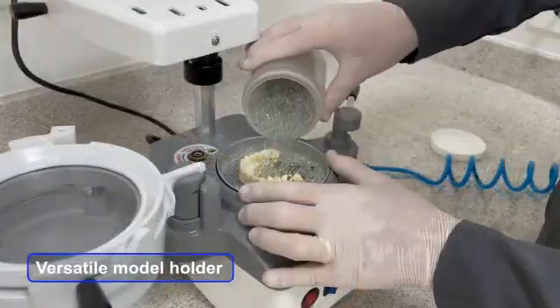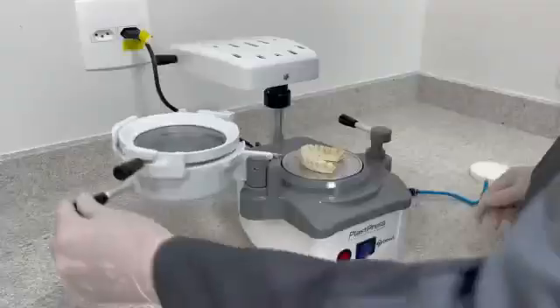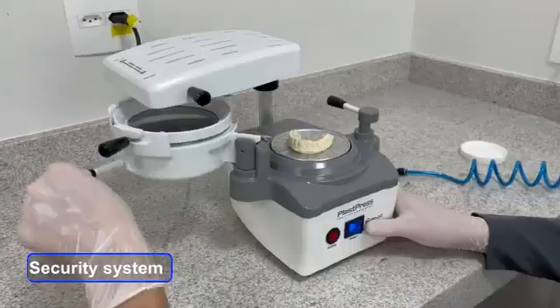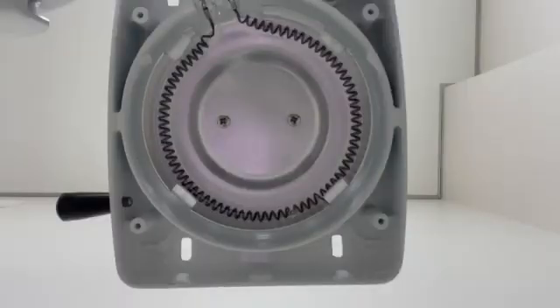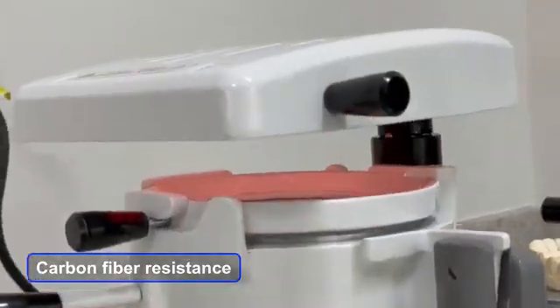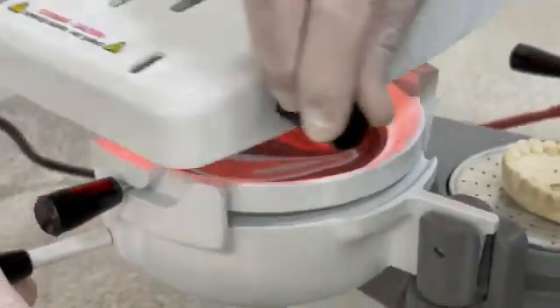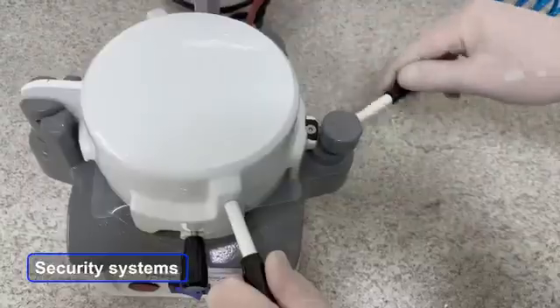Model holder with dual function: mug and flat. Micro switch for resistance operation. Fast and even heating. Automatic pressure activation through valve.